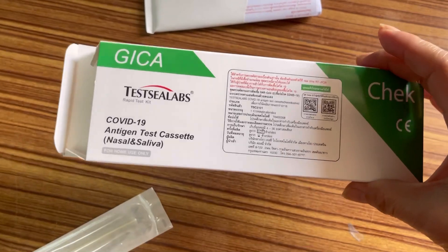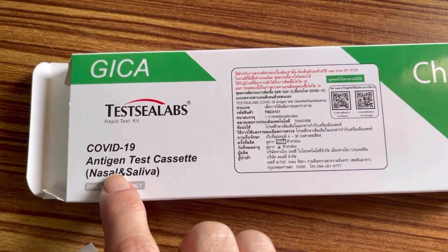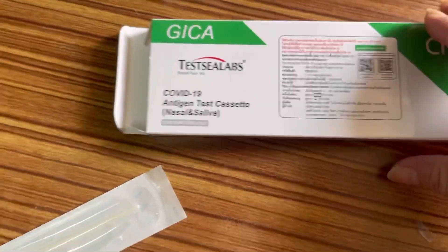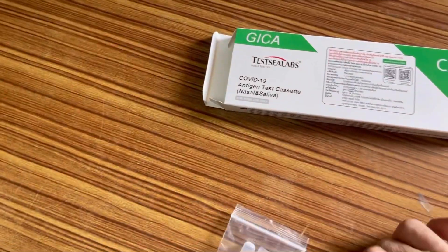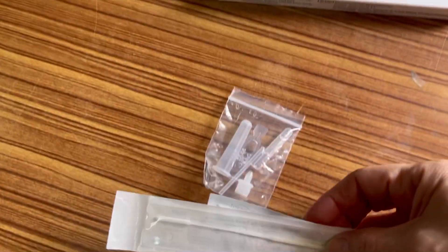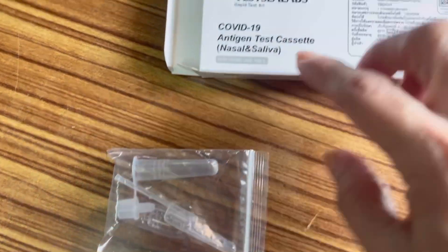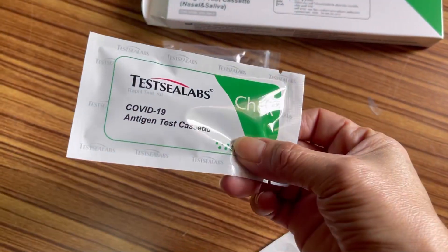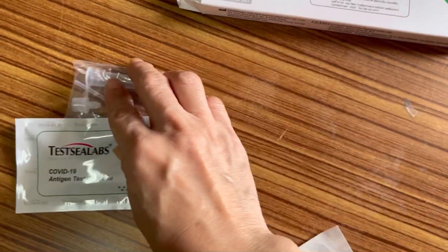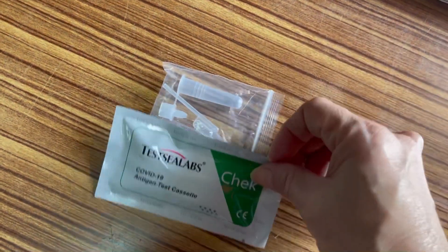As you can see, this is the Test C Labs two-in-one kit — you can check nasal or saliva. If you want to check nasal, you need the swab and this tube. If you want to check saliva, you need this tube, this cassette, and this tube for the saliva.